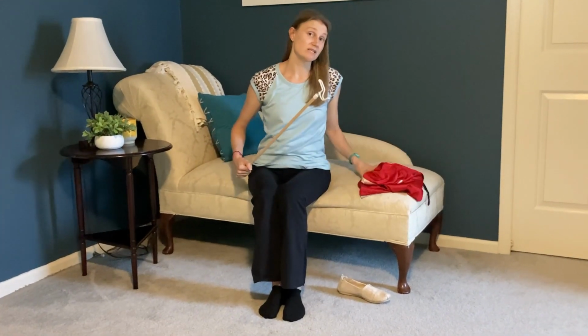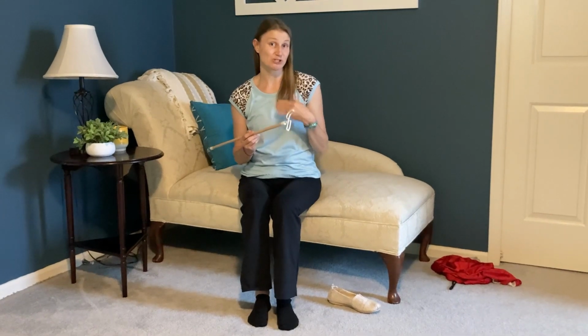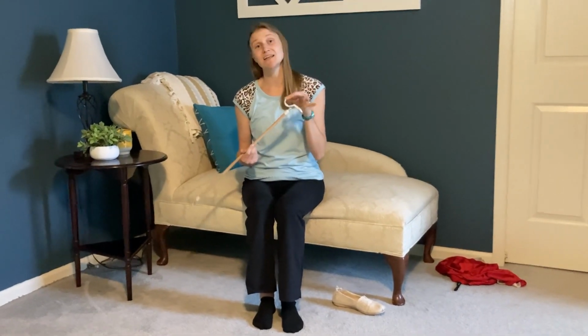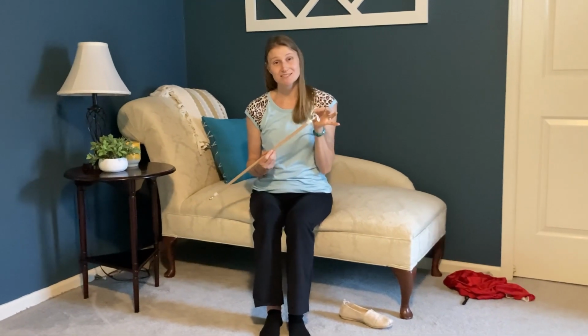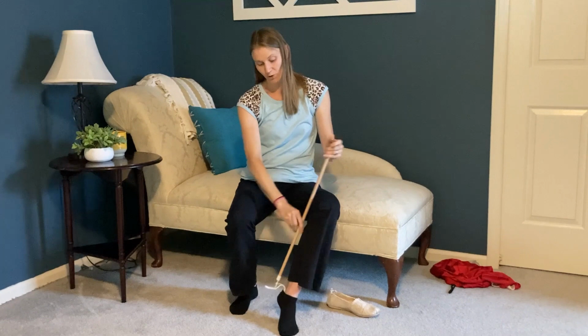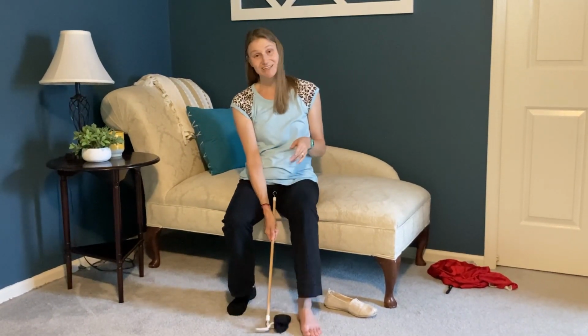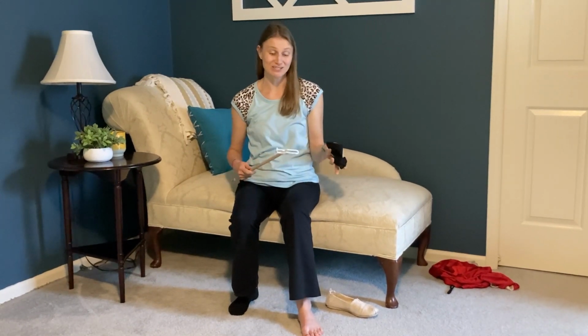You can also use your dressing stick to help with taking socks off and also for managing your shoes. This hook that's facing in the upward direction is very helpful for helping to take off your socks. Some people like to use their reacher for taking off socks, but I have found that the soft coating at the end of the dressing stick makes for a much more comfortable experience with a decreased risk of tearing or ripping your skin. So take this so that your hook is facing downwards. You can hook that on the part of your sock and slowly put downward pressure, and it is helpful for getting that sock off of your foot.